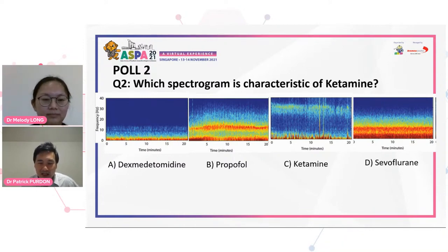Another thing, I think there was a little confusion between propofol and ketamine, and the key thing with ketamine is that, again, it's playing these higher notes, maybe closer to 30 cycles per second, compared to the alpha band, which is like at 10 cycles per second. So with propofol, you get 10. With ketamine, you get a really concentrated wave around 30. And so that's how you know ketamine, again, playing those high notes. That's how you can tell the difference between ketamine and propofol.